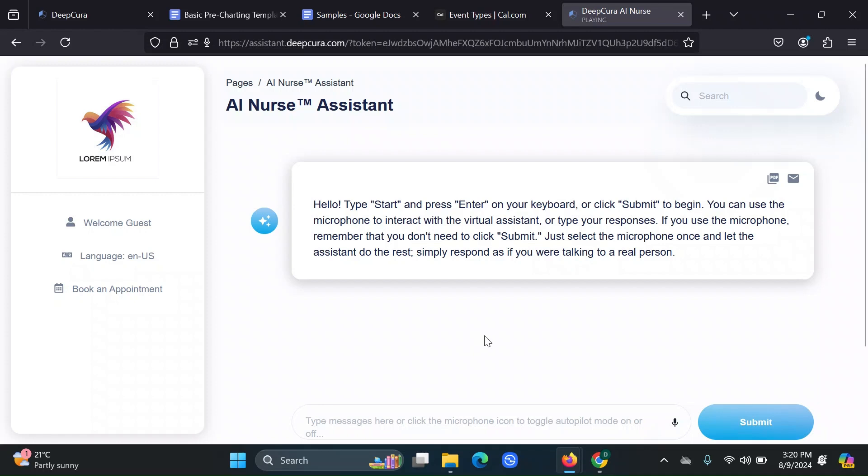So as you can hear, it has a voice, a pretty natural sounding voice. And if you use different languages, it's going to be able to speak in those languages. The first thing we notice here is the sample logo that we have added. So in your case, it's going to be able to show your logo, which is pretty cool.